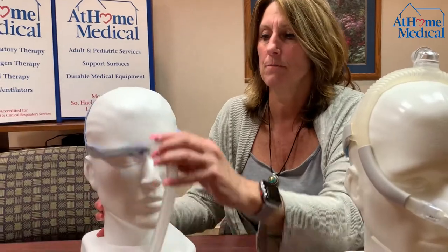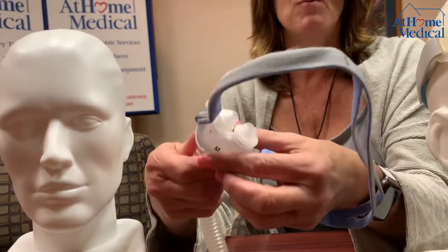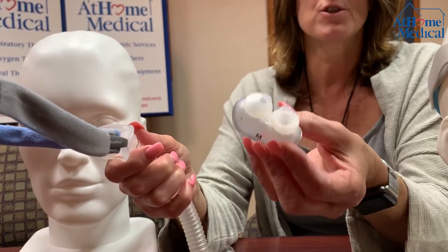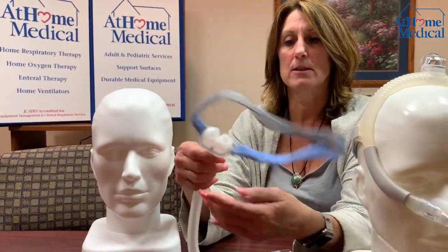I'm going to start with the nasal pillows. These come in a size of small, medium, and large. To take them apart, you pull this out. This gets washed every day under soap and water — regular dish detergent water — and so does the tubing. Air dry it and click it back into place.